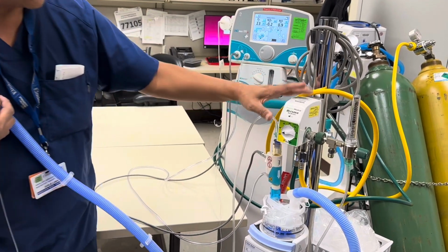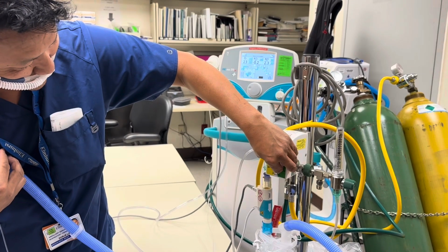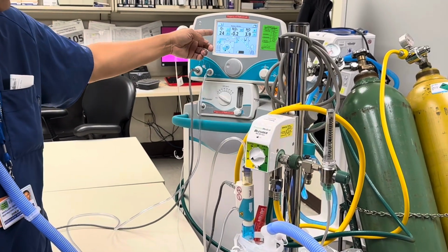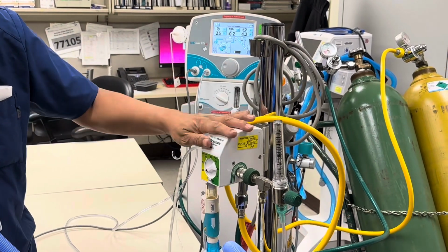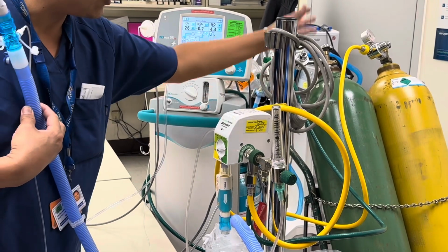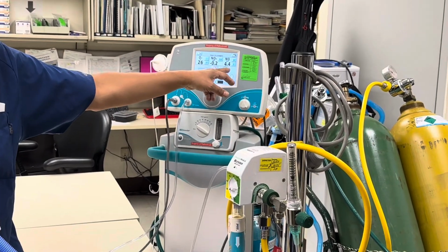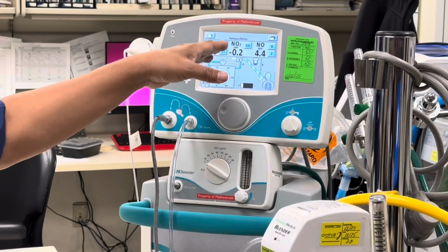And then because it's a blender, I set it at 30 or 28%, whatever the doctor wants. And it's at 28% right here. Now this is a blender, so the 50 psi for air and oxygen both has to be connected to the wall, from the air to the oxygen to 50 psi. So you're gonna see here now the NO is reading close to 5, and then NO2 is reading less than 1, so we're good.